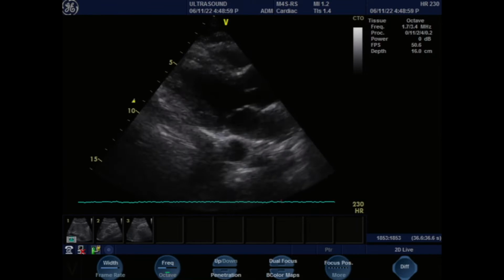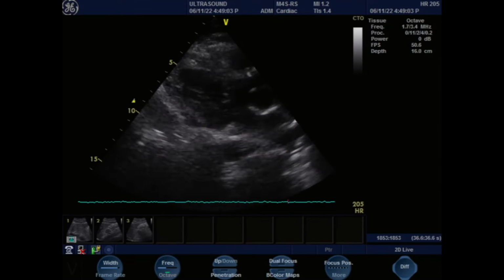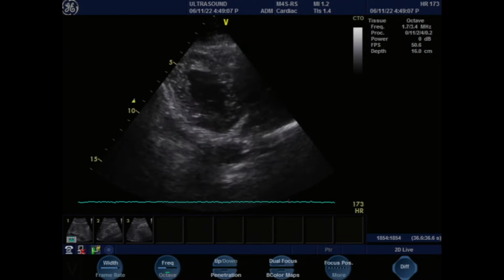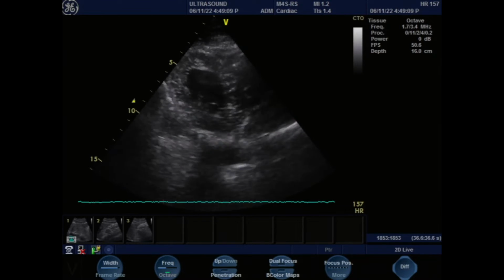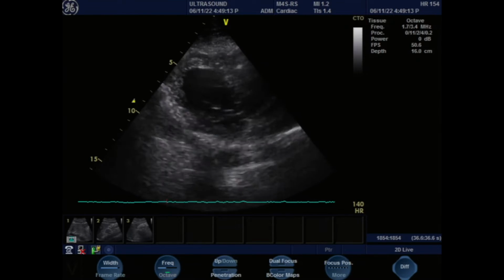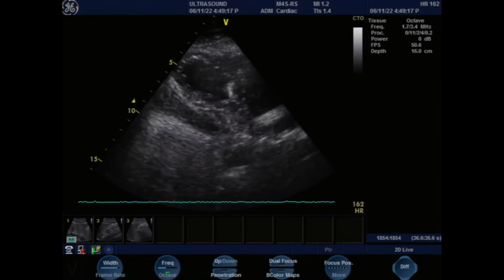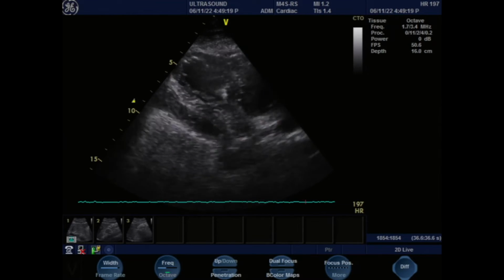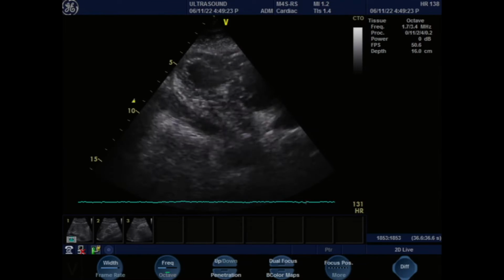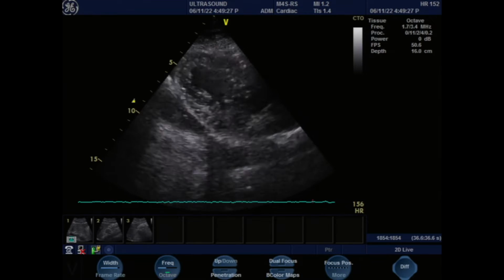Now, what I'm doing over here, I'm just going to switch my hand. It's going to stay over here. I'm just going to rotate this a little bit. You see, look at the probe rotating. And now we went from an oblong heart to a circular heart. So we've kind of gotten rid of all our valves and everything. But what we're looking at over here is the heart cut as a cylinder. You know, the heart is a cylinder. So now you're cut like a donut, right? You're looking at a donut here. So you're seeing all the walls coming in and squeezing over here.